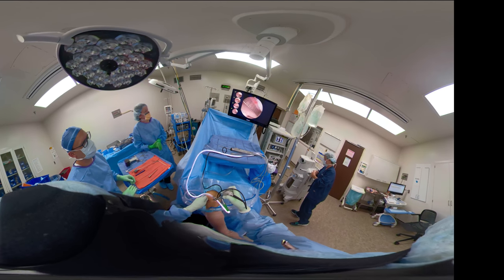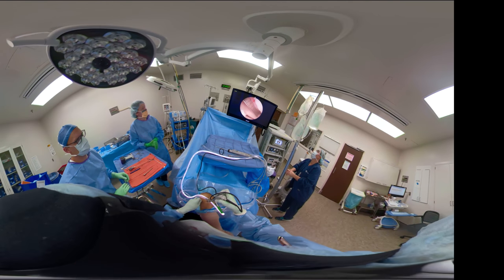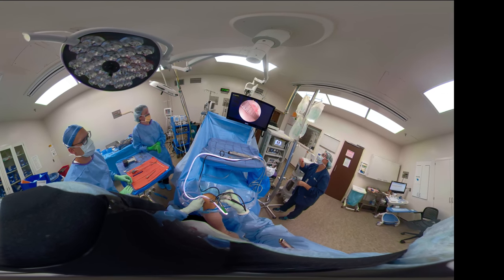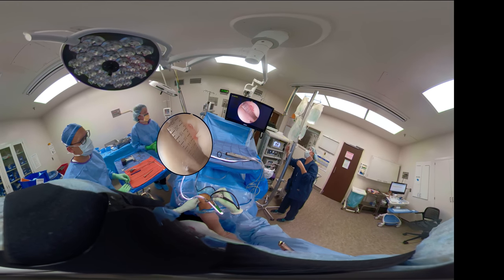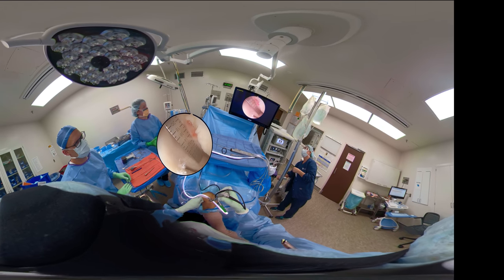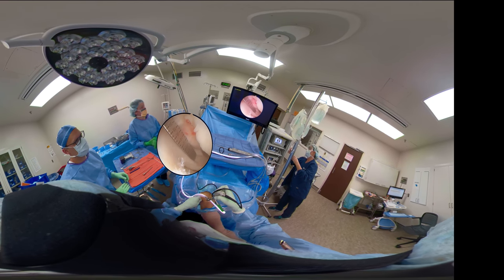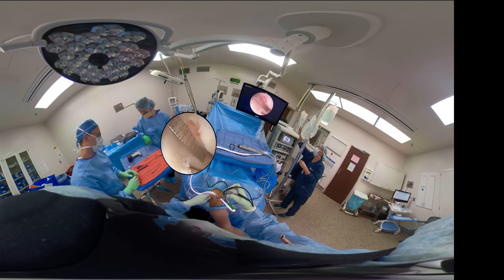Pretty big defect. You can see we've debrided this. You can use a curette or your curved full radius resector to get good edges, walls around the defect. And now you can see on that all inside on the left the size of the defect. And you see it almost looks like it's down to bleeding bone. This patient's injury was about 2 months prior to this arthroscopy.